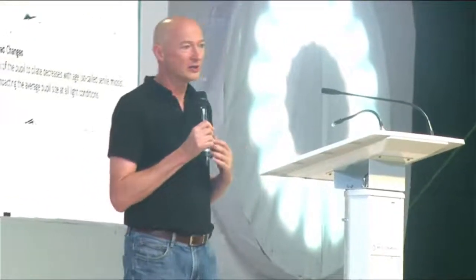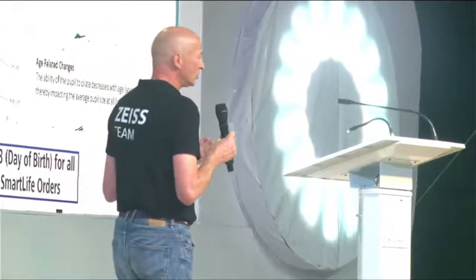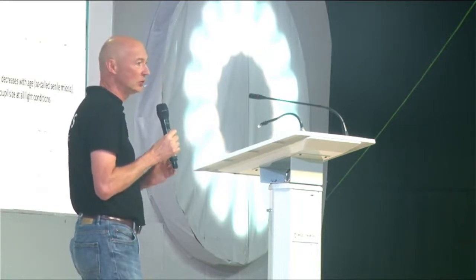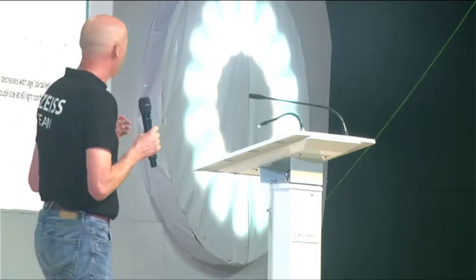Now, for Smart Life lenses, for all designs, we ask the date of birth. And why are we doing that? Because a certain addition corresponds more or less with a certain age. It's the same with the opening of the eye. When we're getting older, the pupil opens less. You know that. So that's why we ask the age, which corresponds on average with a certain opening of an eye, and that's the opening we will use to calculate the luminance technology so that you get the clearest images possible for that opening, for that age group.